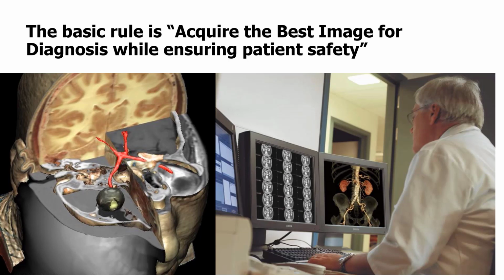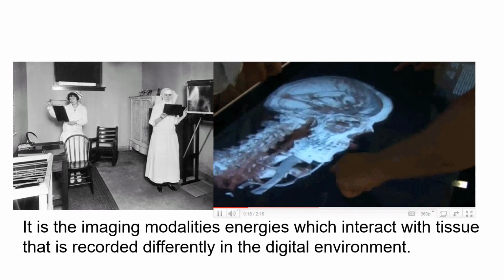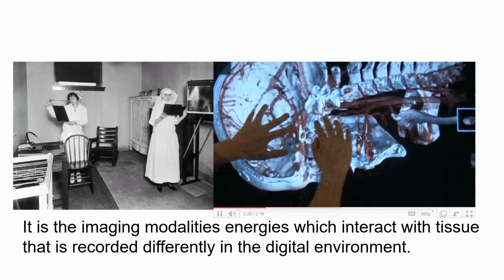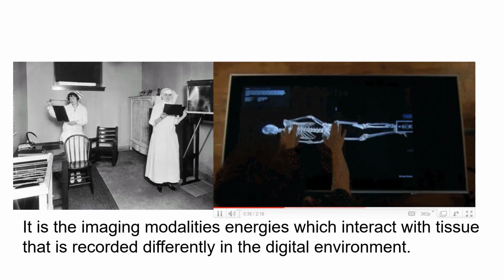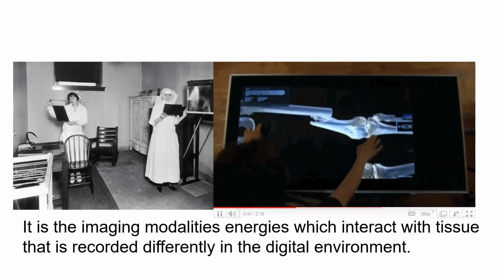The radiologist cannot diagnose information that they do not have, so it's critical that the radiologic technologist understands what needs to be acquired and how it should be done properly. It is the imaging modality's energies which interact with tissue that is recorded differently in the digital environment from the old film screen environment, allowing us to manipulate the data and create several images from the information that we've acquired without re-exposing the patient. The Rad Tech's job is to get the pertinent information and be able to acquire the images.